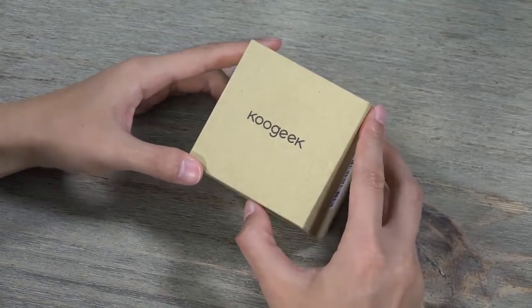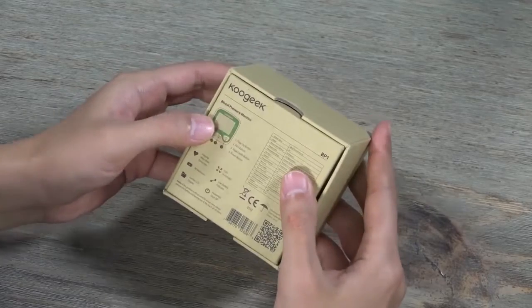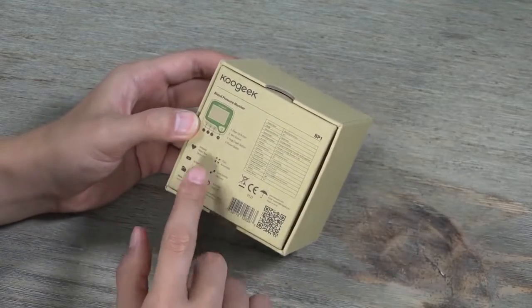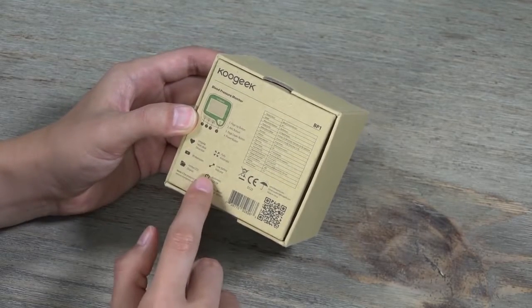Hello guys, today let's take a look at how to use this KUGIC blood pressure monitor. There are four buttons on the device and six features.